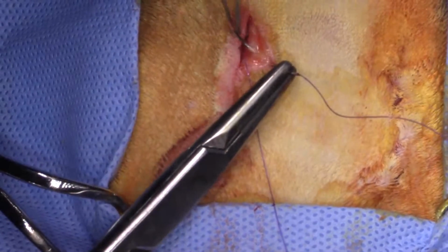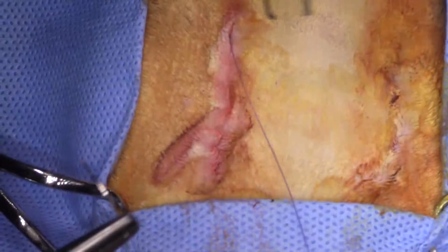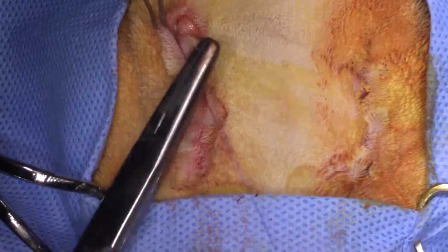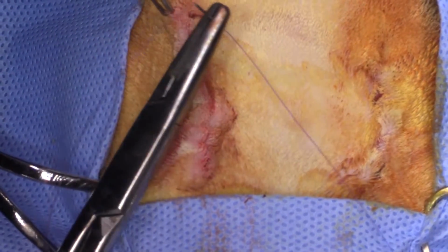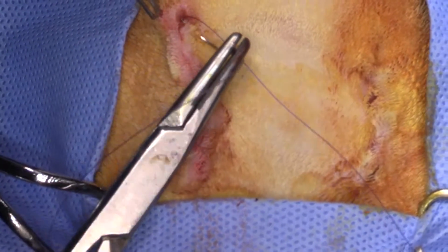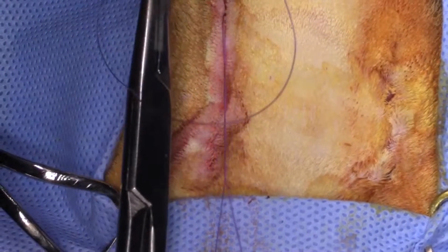So guys, check your YouTube community posts later on today, because I will definitely try to get the CT scan of this one, and I'll try to take a photo of the polyp in the oral cavity as I pull it out, and then I'll post those onto the community chat or community message board. Pull both of those cranially, please, or rostrally. Other rostrally.